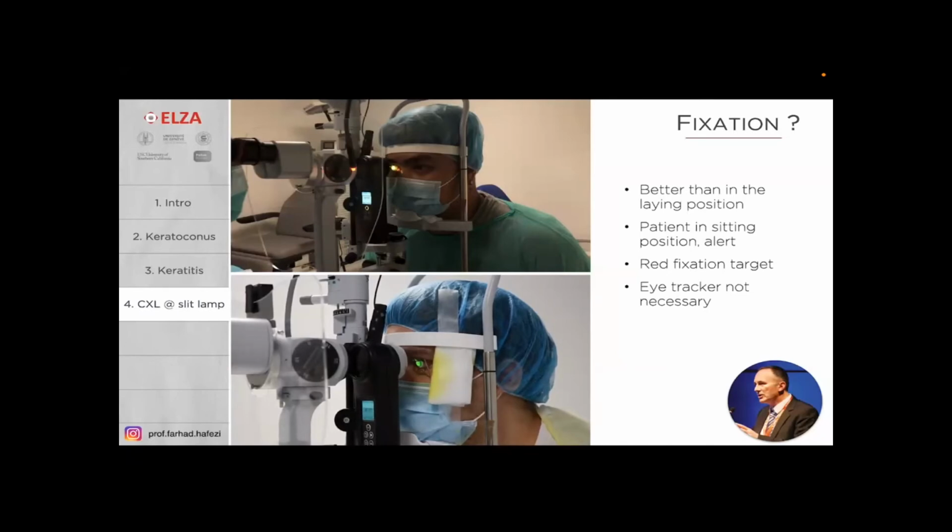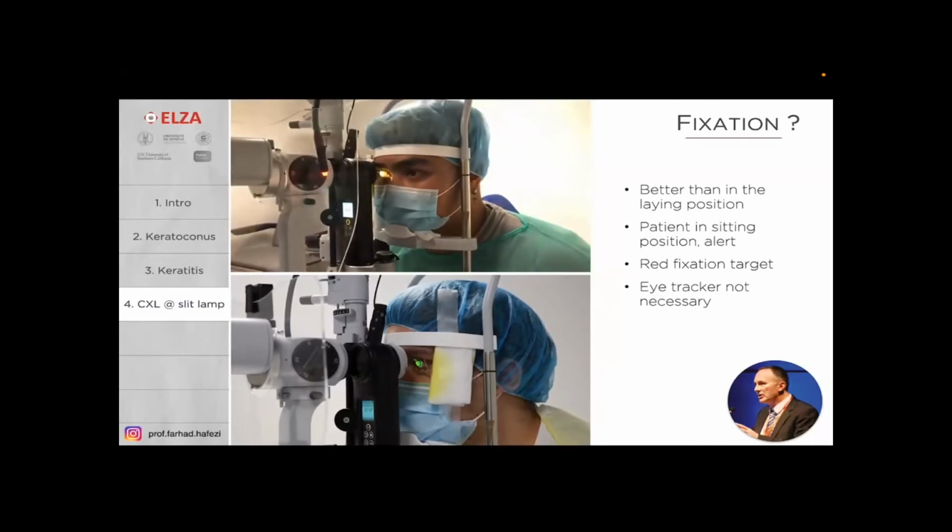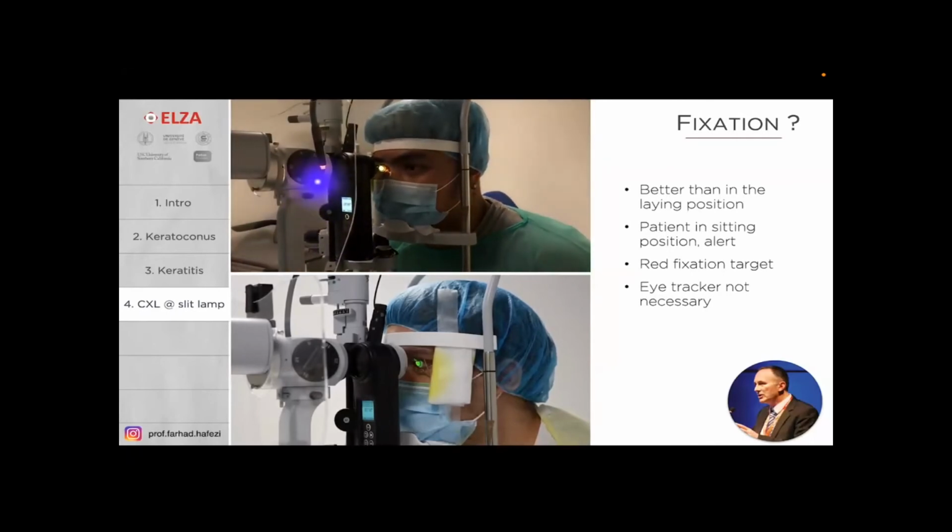Now I will switch on the upper video. Again, very nice fixation. See this fixation light? This is for the other eye. So the patient has a very steady fixation target on the other eye, and this helps tremendously. So fixation is really not an issue.